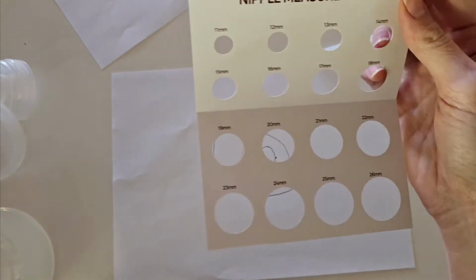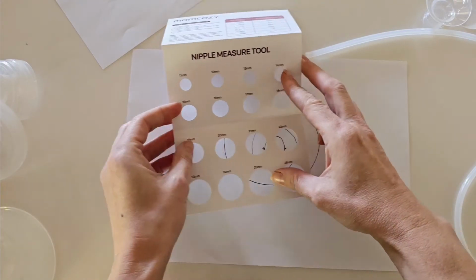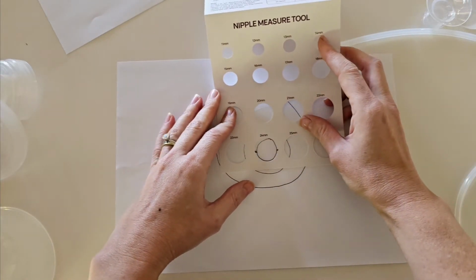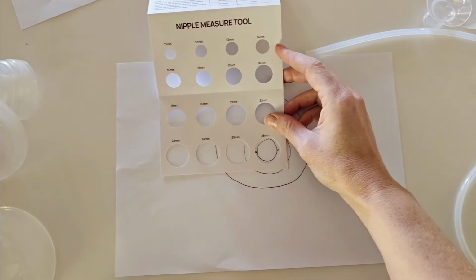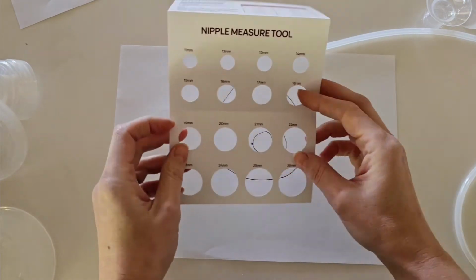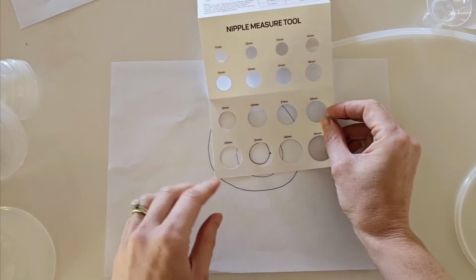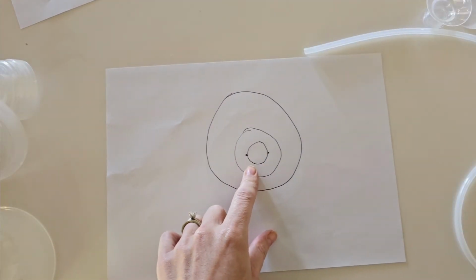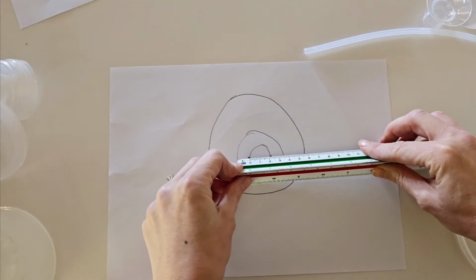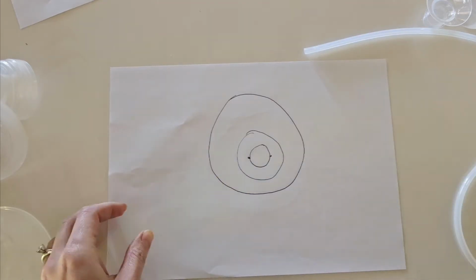So with a nipple measuring tool, you can simply slide this over your nipple until you find a sizing that fits. If again it is too large, you are going to want to go down a smaller sizing. So here you can see that this wouldn't even fit over the nipple. So I would say around a 21 to possibly a 24 would be a great sizing for this. Again, you can grab a ruler. Now it is in millimeters and we can simply just measure. So this is around a 22 to a 23 sizing.